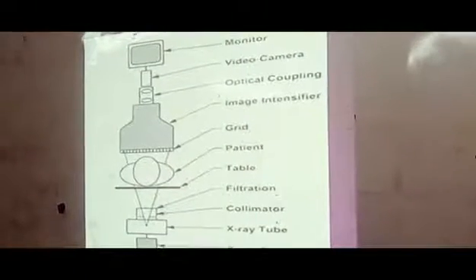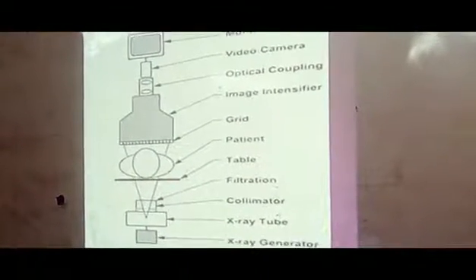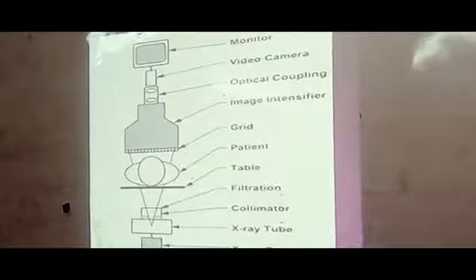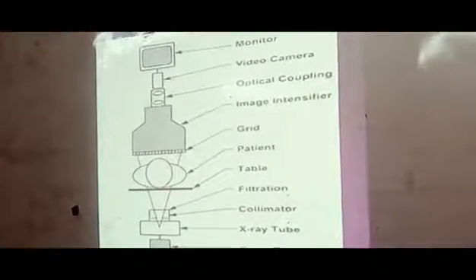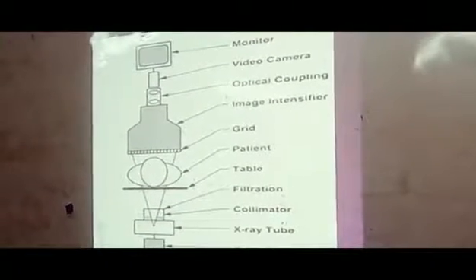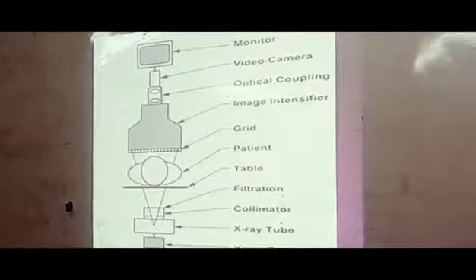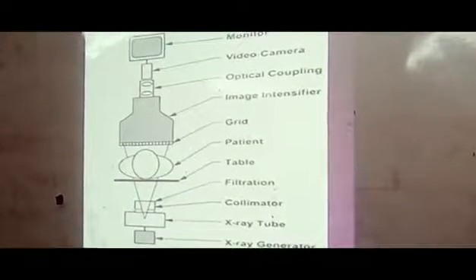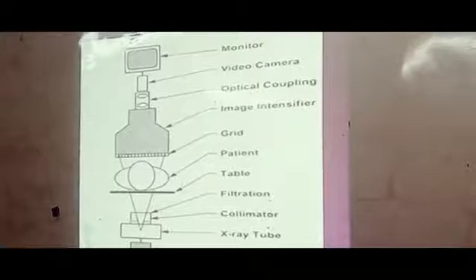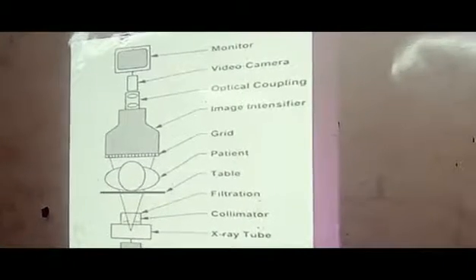The beam filtration. It is common for fluoroscopic imaging systems to be equipped with beam hardening filters between the X-ray tube exit port and the collimator. Added aluminum or copper filtration can reduce skin dose at the patient's entrance surface, while a low kVp produces a spectral shape that is well matched to the barium or iodine K-edge for high contrast in the anatomy of interest. Insertion of this added filtration in the beam path may be user selectable, providing the operator with the flexibility to switch between low dose and higher dose modes as conditions dictate during a fluoroscopic procedure.